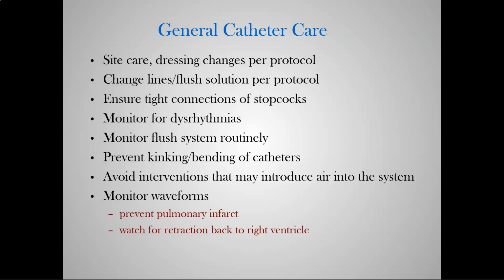You still can insert peripheral, like PICC lines, for example, still a central line, okay, peripherally inserted central catheter, but you're not always going to be on cardiac monitoring unless your hospital indicates it. Okay. I personally like to have cardiac monitoring purely because when you tickle that right atria or advance it a little too much and you tickle the bottom there where the tricuspid valve is, you can cause some dysrhythmic rhythms.